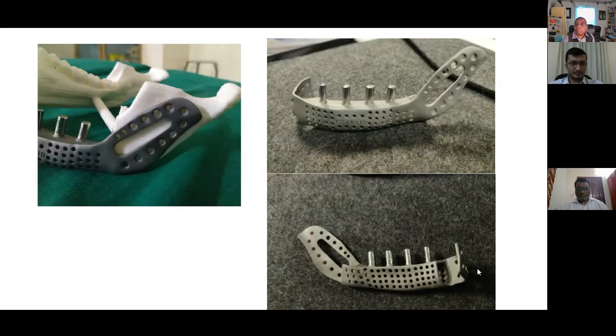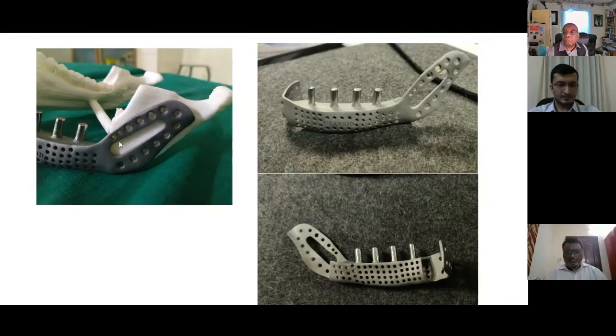During the planning, this was what we went through. It was a hollow prosthesis. We have a cut end here, a cut end here, and a cut end there, with cortical on the outside and cancellous inside, and the cancellous part should be abutting this hollowness and porosity. Over this you have a periosteal pouch, wherein the periosteal reaction on the biocompatible material enabled new bone formation.